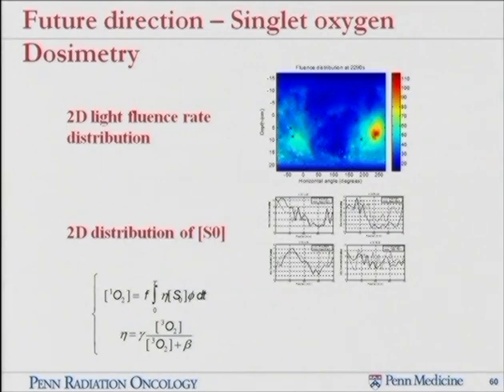The only modulation is the additional oxygen-dependent singlet oxygen quantum yield, which takes into account the light fluence effect. So the first step for us is to determine the PDT dose in clinic settings, and the next step is to take into account the additional light fluence effect. This quantity can be relative, of course, as a dosimetry quantity.